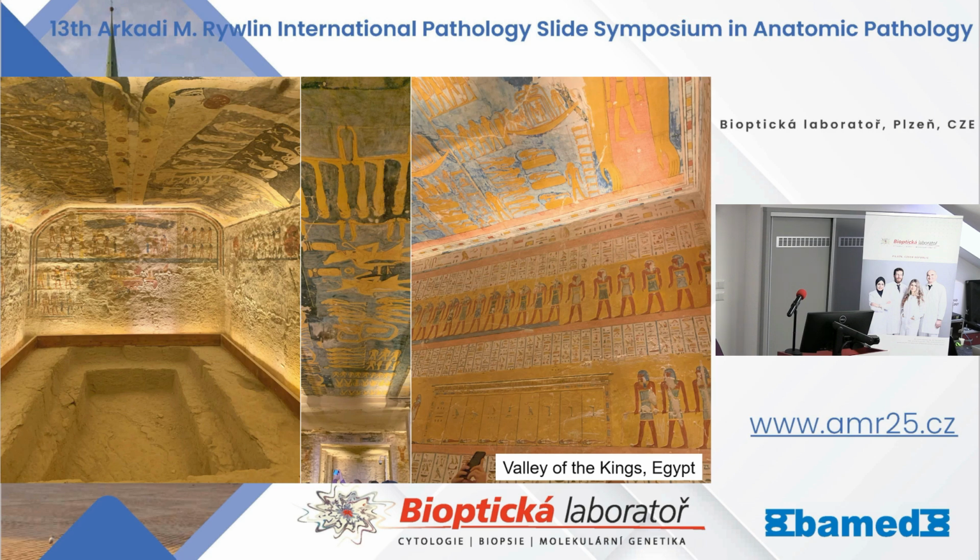Thank you very much. This is all. Thank you very much for this very quick and succinct walkthrough of chromophobe. Questions and comments? Jonathan.